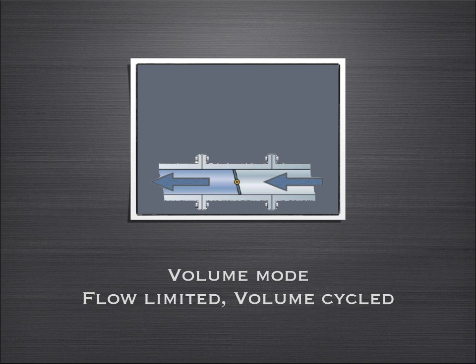What's happening is there is a continuous airflow through those ventilators, somewhere between 20 liters per minute all the way to 60 or 70 liters per minute. If you close the valve, the air will go to the patient. So let's say you have a flow of 30 liters per minute. That means you have a flow of half a liter per second, because you have 60 seconds, 30 divided by 60. If you close the valve for 1 second at a flow of 30, you will have 500 cc go to the patient.